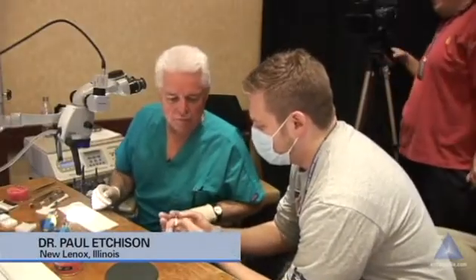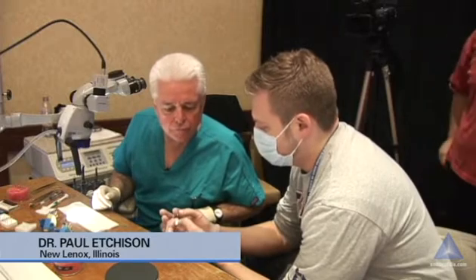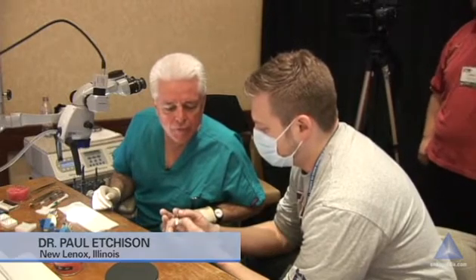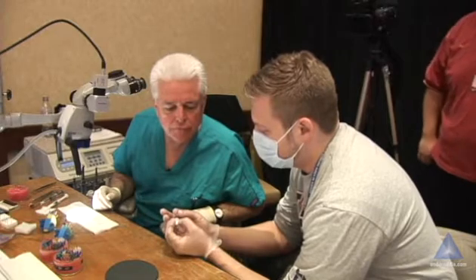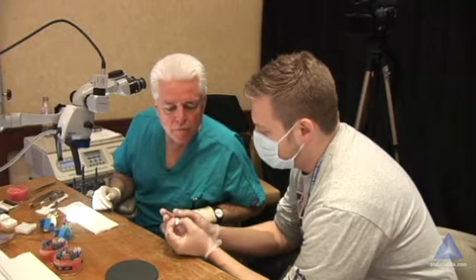Just one thing I want to tell you — one reason I take the course is I'm always turning, turning, getting it lodged in, then I wiggle it out. Lodge it, lodge it, lodge it, wiggle it out. Now you kind of just go until you get rid of it. That's perfect.